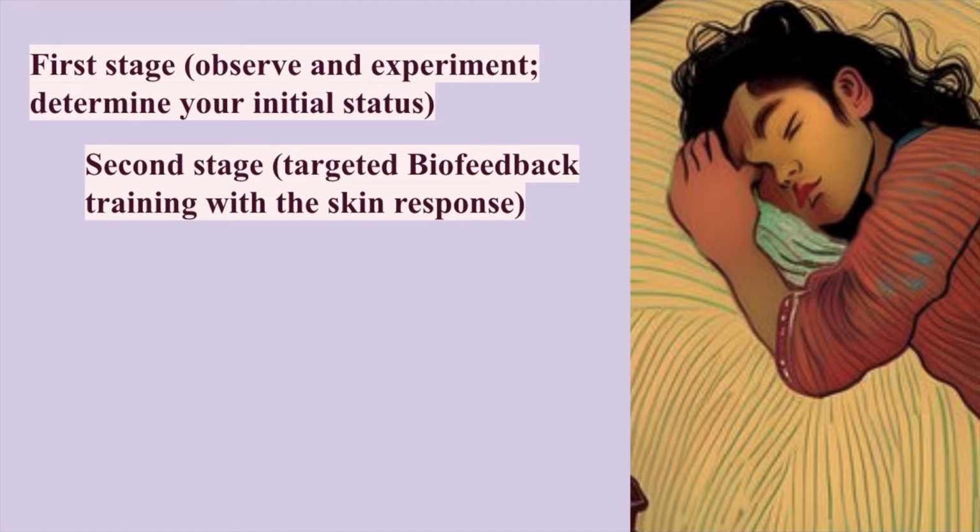How would you judge your ability to relax during the exercise? Maybe you can already find dependencies between the objective measurement and the subjective feeling of relaxation or excitation. If you find no connection, don't worry. You will find a connection during the sessions to come. Keep notes on the general level of the curve and the approximate number of fluctuations per minute to know your initial training status. Note if there's a general increase or decrease in the skin conductance response over time, and also keep in mind what your tonic level is.